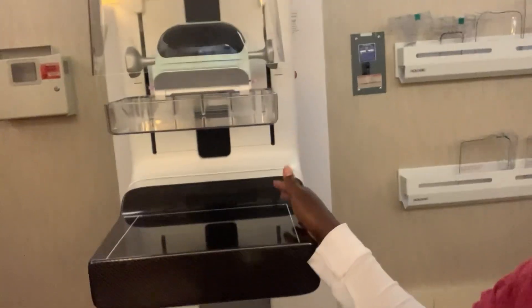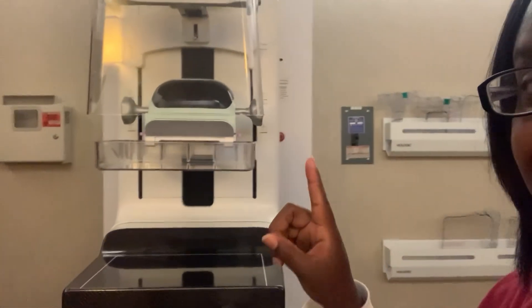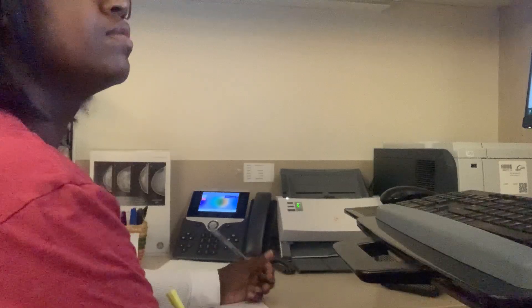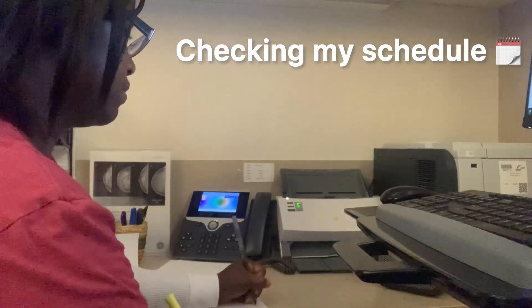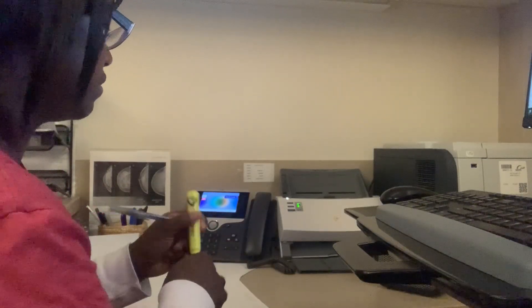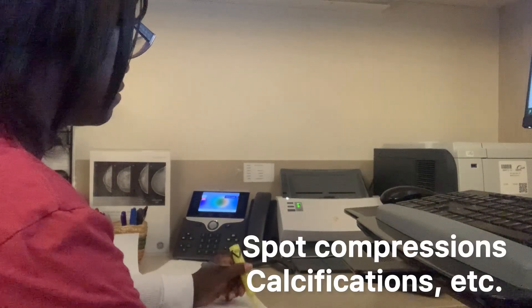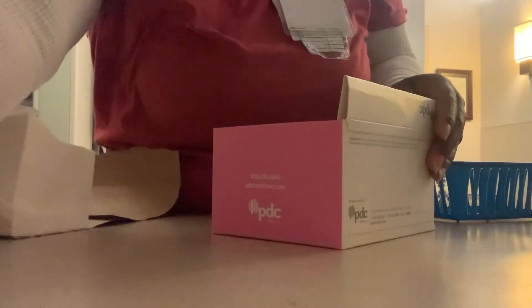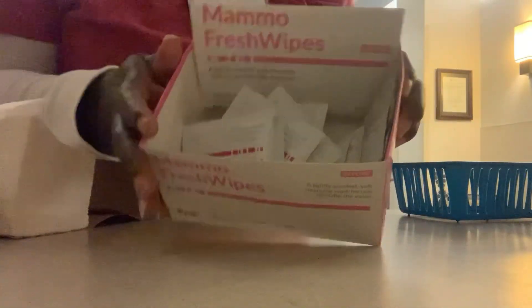Hello everyone, today I'm working in mammography. Here's our mammography machine and today I am working on the diagnostic side. I'm showing you all what I am doing today — those are the compression paddles we're using. What I like to do first is check my schedule to see how many diagnostic patients I have, what type of exams I need to do, and what is the reason for the diagnostic exam.